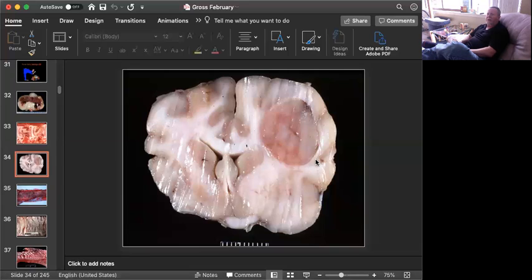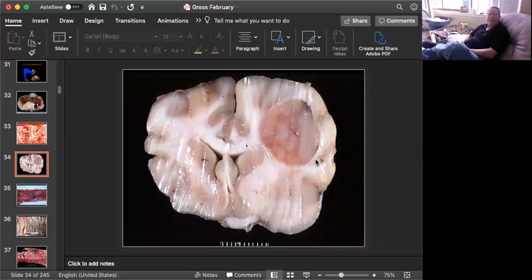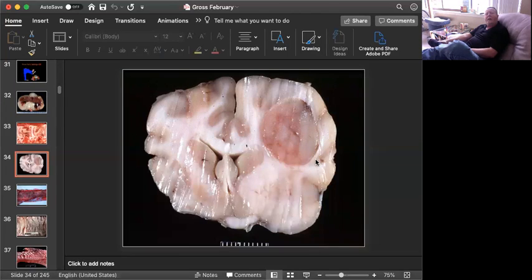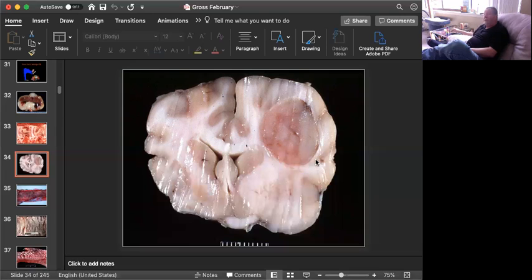Not four classifications of astrocytomas like they used to be, which it was easy to identify the highest grade, but not so much one, two, or three. Now it's just low-grade or high-grade, and I recommend everybody get a copy of that. Also, it's a very nice review of different types of immunos that you can use to differentiate these tumors and how fixation will affect each one because they can be very labile. So there's a classic gross appearance of a low-grade oligodendroglioma arising in the white matter of the cerebrum.